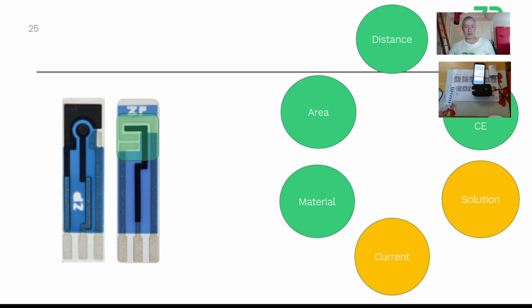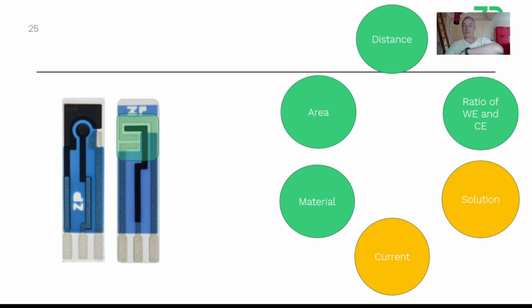I just threw that one in at the end there a little bit, because if I was trying to make a glucose sensor, because I've got so many membranes involved, it often just restricts the current anyway, and by restricting the current, we end up improving the situation with the compliance voltage. So when people ask me what's your compliance voltage, it's extremely nuanced.